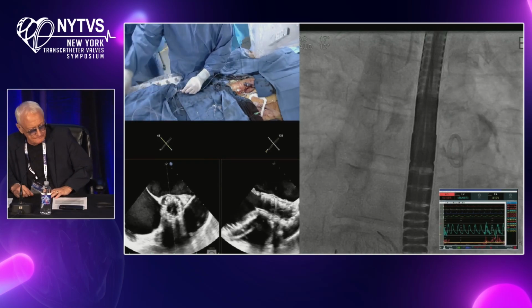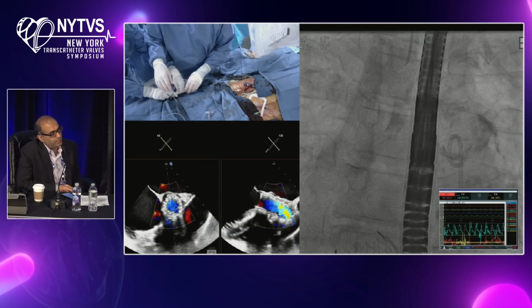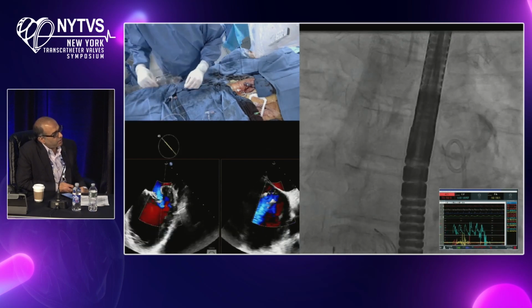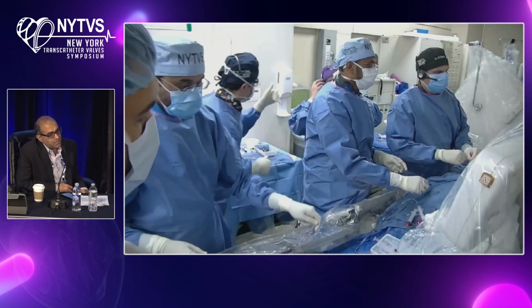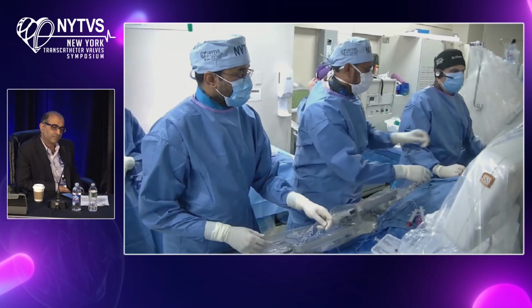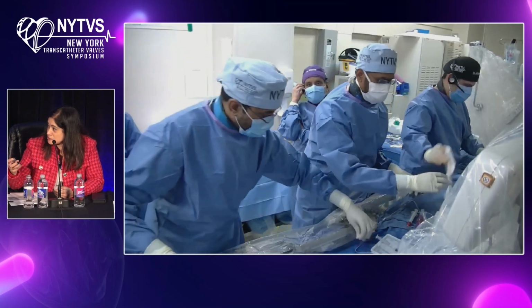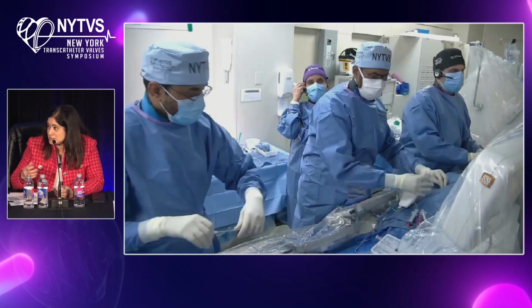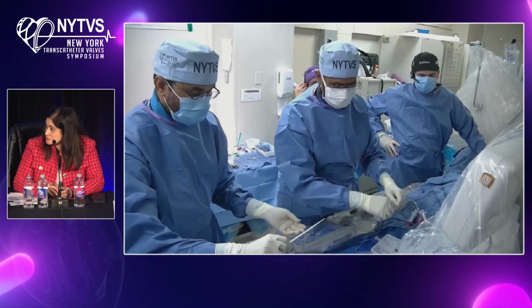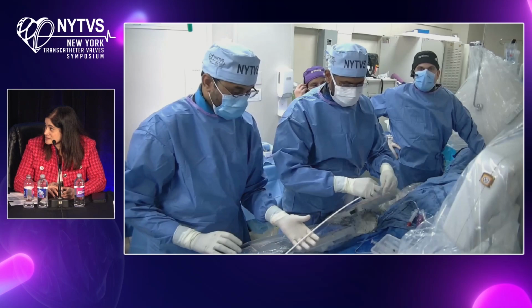Yeah, good point. I think the real question is, what would be your pharmacotherapy now, post-TAVR? Because the underlying mechanism, at least in this case, was HALT. This patient is 82 years old, so would you keep this patient on anticoagulation lifelong, or a few months, or no anticoagulation at all? I think that's a great point, because if you look at this case, it looks like that leaflet is being held open by that thrombus. With all the dysfunction, you'd want to keep them on anticoagulation. I think you have to balance it with the individual patient's risk of bleeding and have that conversation before.